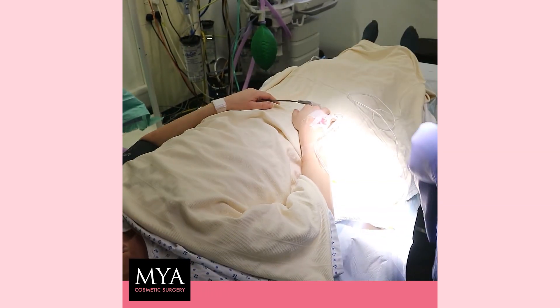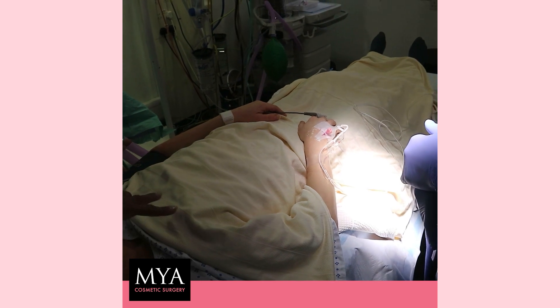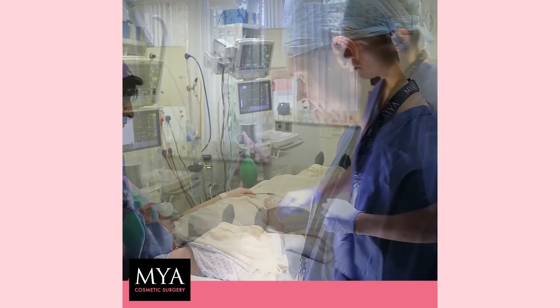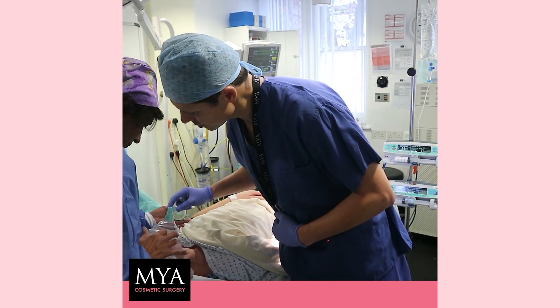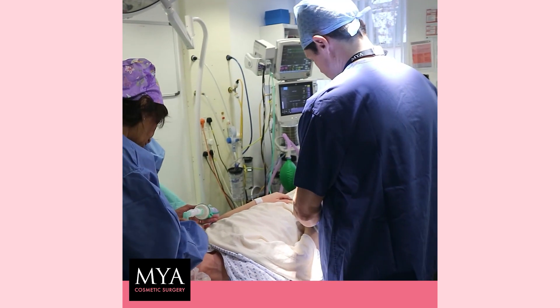That will take you off to sleep in about a minute or two. So think of something really, really nice and we'll see you very soon when it's all finished. Happy thoughts. Open your eyes for me. Nice deep breath. Nice deep breath. Nice deep breath — just get your breathing going a bit.